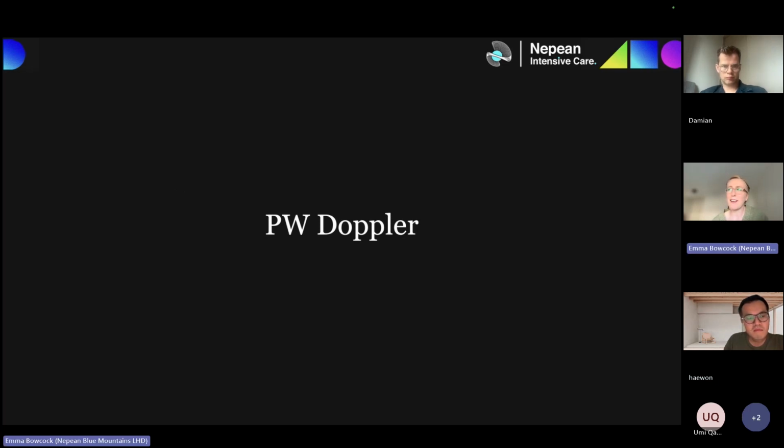All right, if I give you an option to use pulse wave in someone with AR, where would you put your gate? Where would you want to sample to help you with severity assessment? Descending aorta. Yeah, very nice. Why is that, Here one? To look for flow reversal, whole diastolic flow reversal, which is a feature of severe AR.